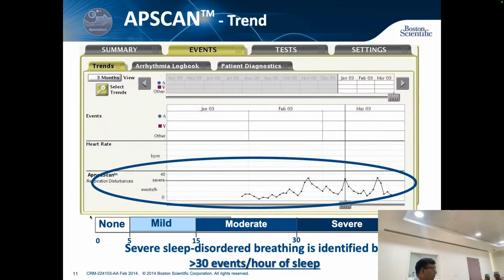A lot of modes, we probably know, but in depth, how it works, we don't know. It is our tech guys who know in depth, and we take their assistance so that they can give a better review of how the system works. You should know the strengths and the weaknesses. If you know the strengths, it's okay. But if you don't know the weaknesses, you can lose the patient, you can complicate the case. Now, with this word, I will move to today's one more topic.